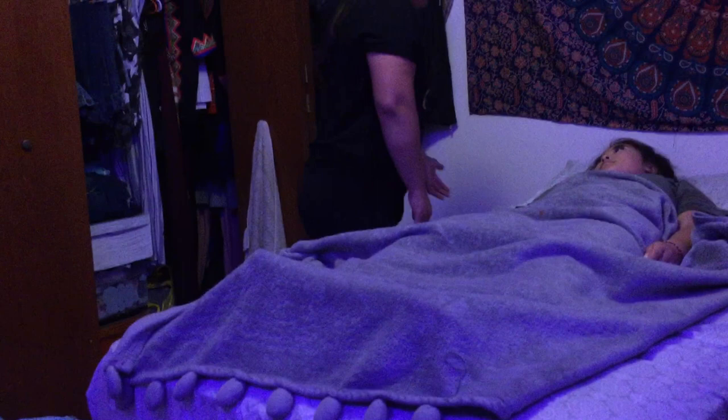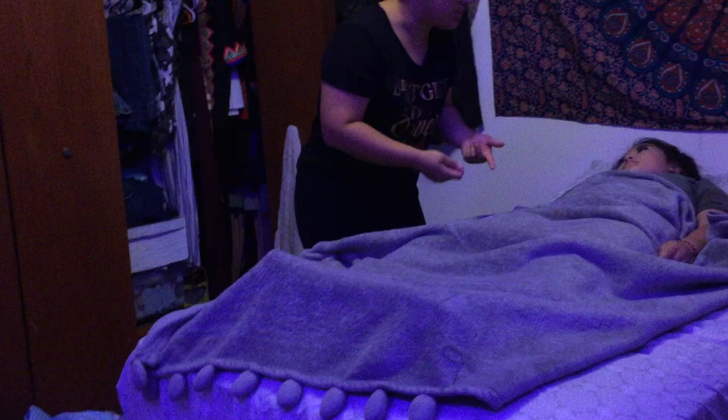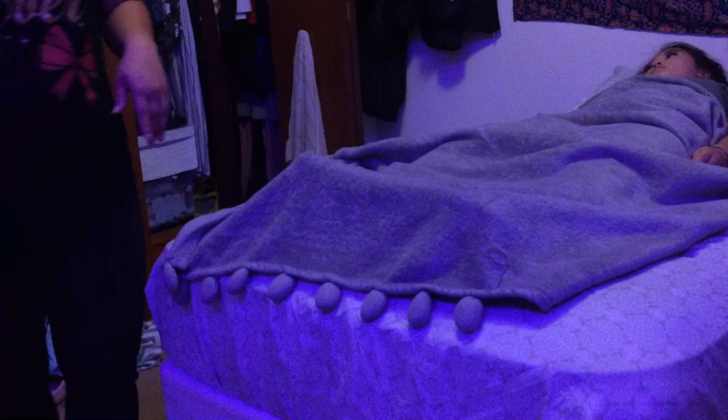So I'm just going to perform some hand hygiene quick, provide some privacy, and I'm just going to lift up your bed just a little bit here so that it's waist high so that I don't have to bend over, okay? I'm just going to lock your bed wheels.